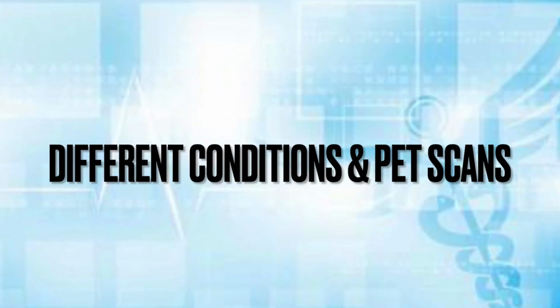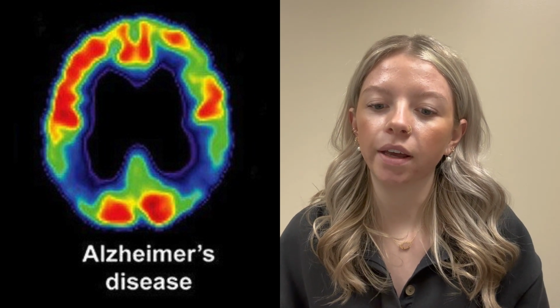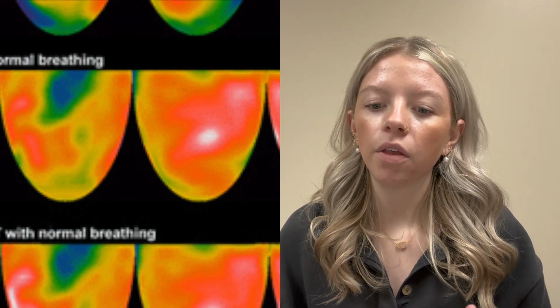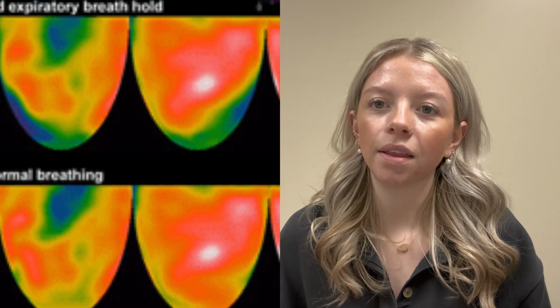With cancer and PET scans, the cancer shows up bright. People with Alzheimer's aren't using as much glucose, so this shows up as less activity and more dark spaces in the brain. The part of the heart that lights up with glucose is the healthy part, while on the other hand, the dull colors are where there's no glucose being used, which also shows that that part of the muscle is decaying. The part that lights up in the lungs is the healthy part. If there was a blockage in the lungs, that part would show up as dull.